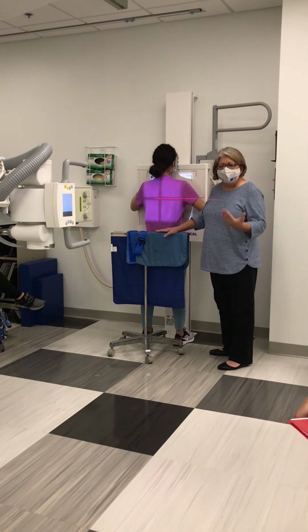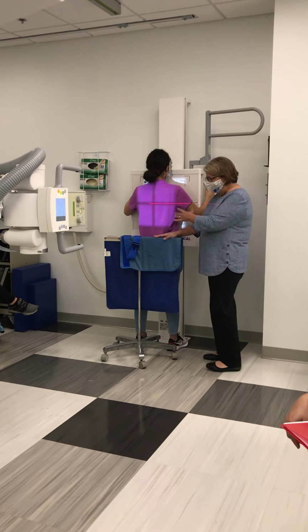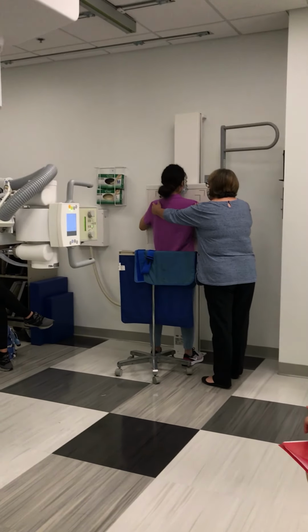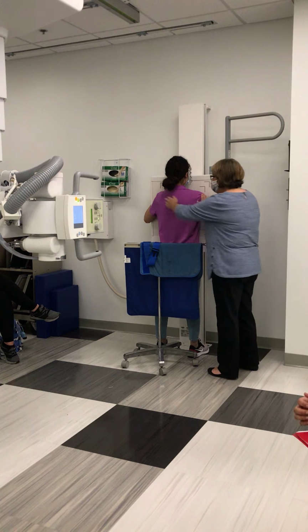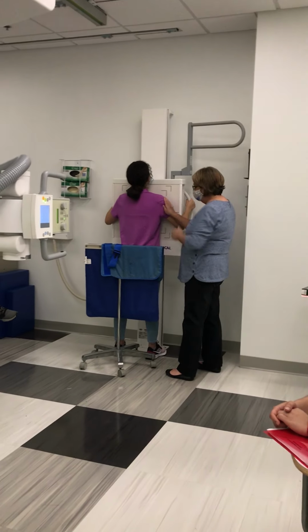Now when you do your simulation, it doesn't matter the height of this. Just make sure that you placed your shield here. Now then I need you to roll your shoulders forward. Roll those shoulders forward. And you don't just tell your patient to do this, you guide their shoulders forward. I need you to raise your chin. Look up.